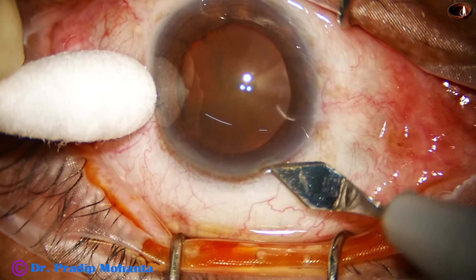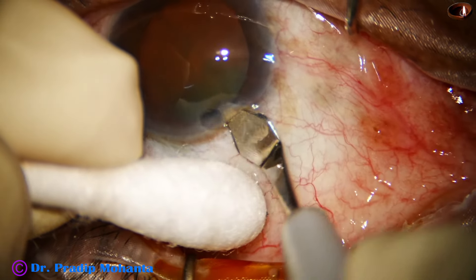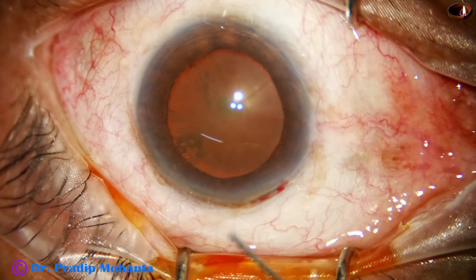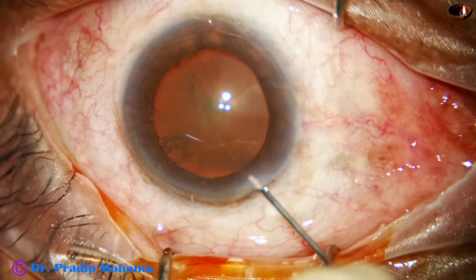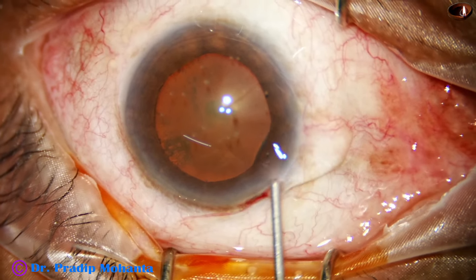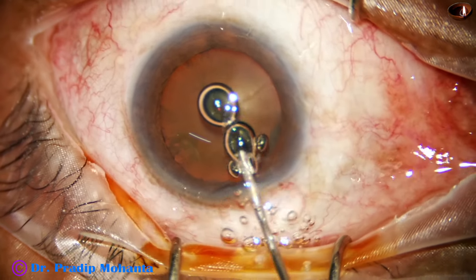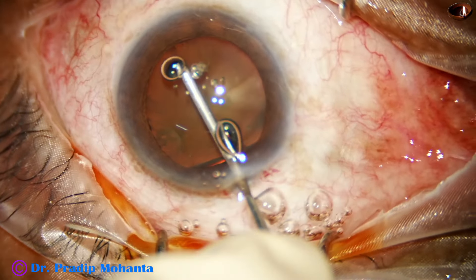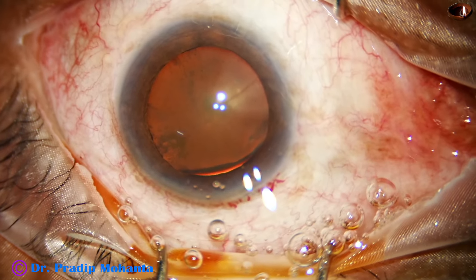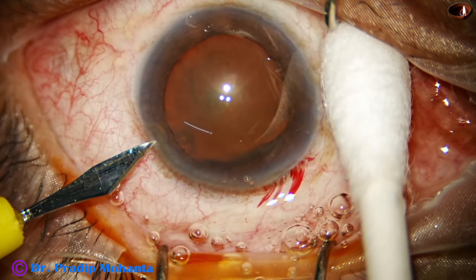This is the main incision with a 2.8 millimeter steel keratome on the posterior aspect of the limbus. This is a totally unedited surgery and you are not going to miss anything. A bit of adrenaline has been injected and now the anterior chamber is filled up with 2% HPMC. I'm not going to stain the anterior capsule though the cataract is hard.